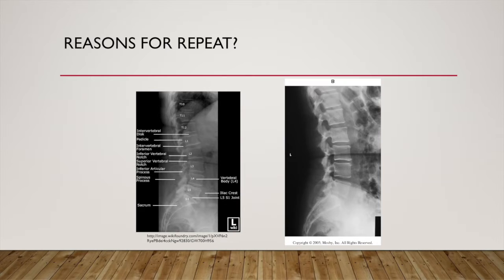Important anatomical checkpoints to determine whether or not to repeat the image would be open intervertebral disc spaces, open and round intervertebral foramina, and borders of the vertebral bodies should be superimposed, meaning that the spine was parallel to the IR. And the spinous processes should be seen in profile, and you should have almost superimposed iliac crests.